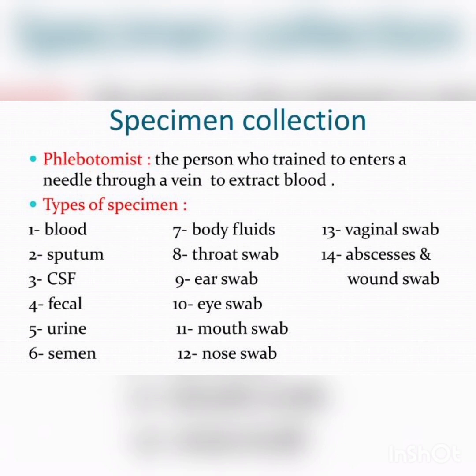You need to use a sterile container so that there is no contamination apart from the causative organism in the specimen. Nothing else should contaminate the specimen. The usual containers are the most useful piece of collecting equipment. There will be a cotton, calcium alginate, or polyester tipped applicator stick.